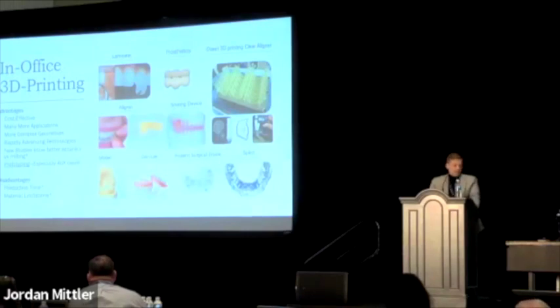So it is more cost effective. There's a ton of applications. The technologies are advancing. And again, I have an asterisk on the study showing better accuracy versus milling because there are a lot of printers out there. Not everyone is as accurate as the next. And for me, prototyping, especially all-on-X cases, is a game changer.